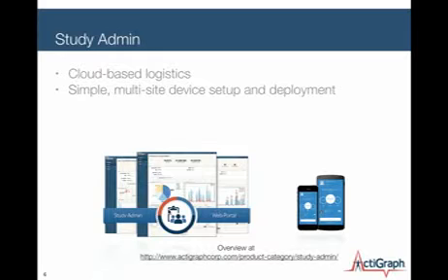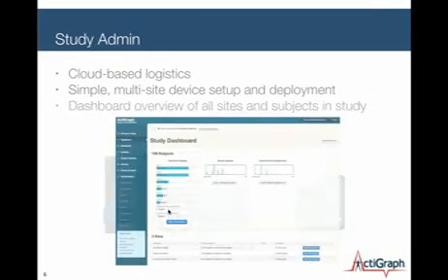And it also simplifies multi-site device deployments in particular because of the reduction in the requirements for setup of a device. It really allows you to pre-configure that for all of your sites, manage your sites from one web portal, and just make it a lot easier on your data collectors. You'll notice the mobile application that's indicated on the bottom right. I don't have a bullet for that just yet, but we also provide the option to grab data and push it into that web portal using mobile devices. And so that's another added benefit of this system.